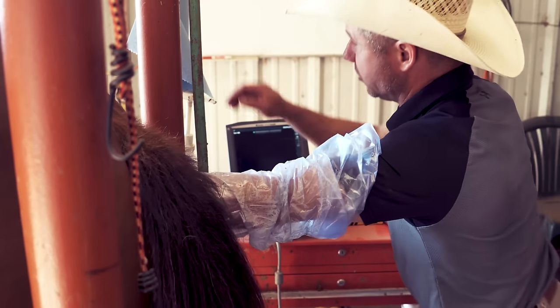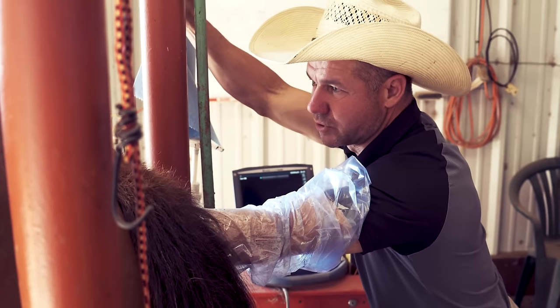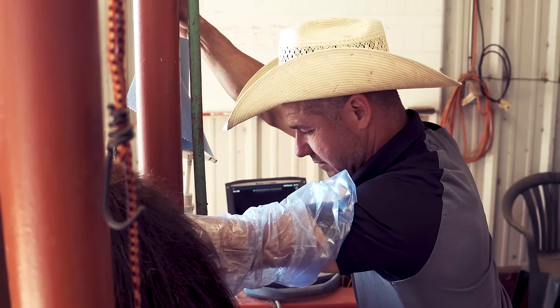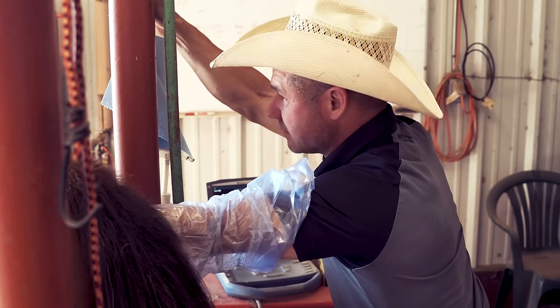So what I'm doing here is I'm just kind of waiting. She's pushing really hard against me. So I don't want to tear a rectum or anything, so I just kind of wait her out.